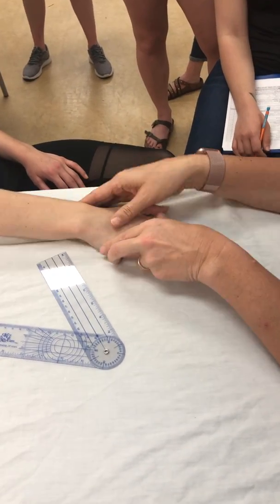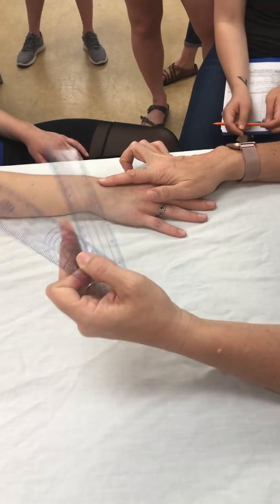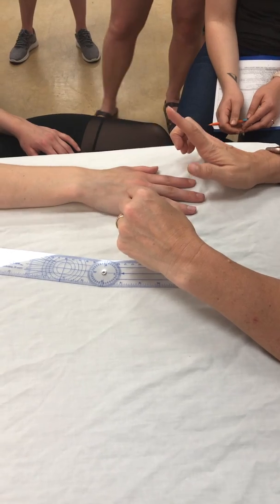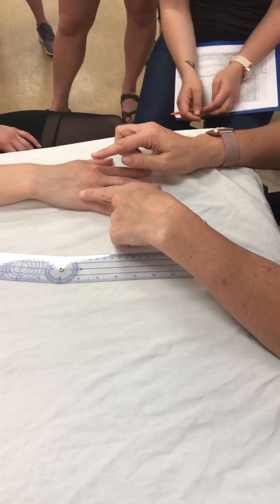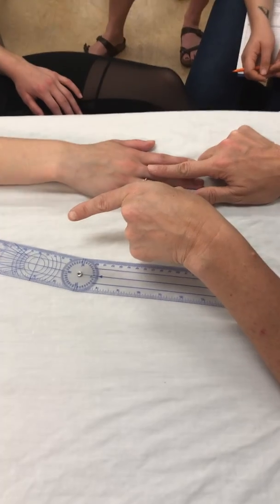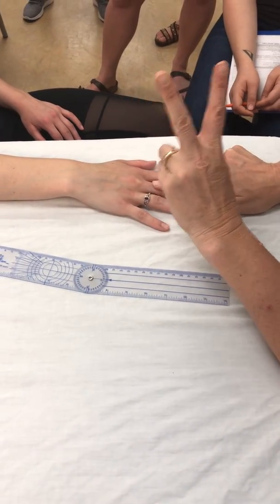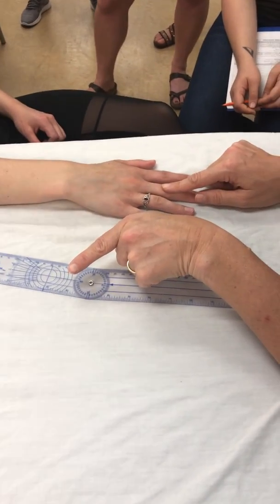The other one that I got a fair amount of questions about was, no, I didn't get questions about radial and ulnar deviation, although I can show you that one. It was MCP abduction, okay? Now remember that, so again, it'll be digits 2 through 4. We can measure abduction of all these fingers. For digit 3, there's going to be abduction in both directions. So I would document that as abduction, MCP abduction, digit 3, and then I would have 2 measures for abduction. I would have one moving in the radial direction and the other one moving in the ulnar direction.